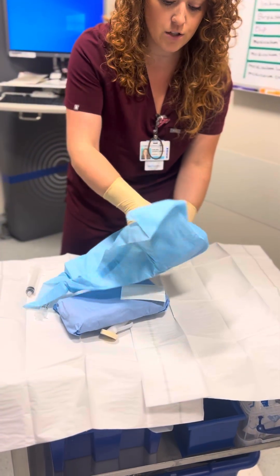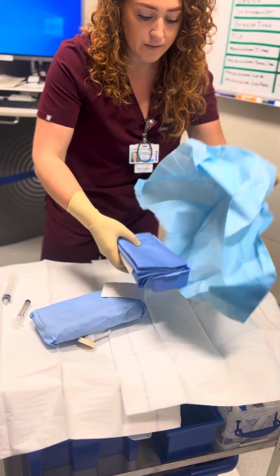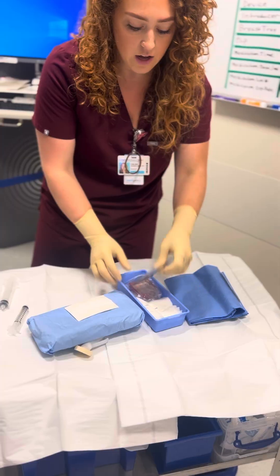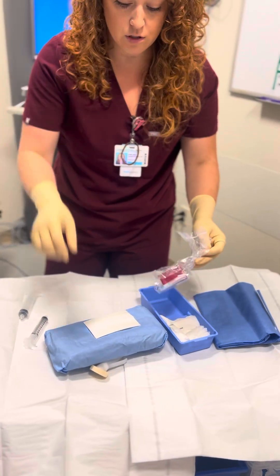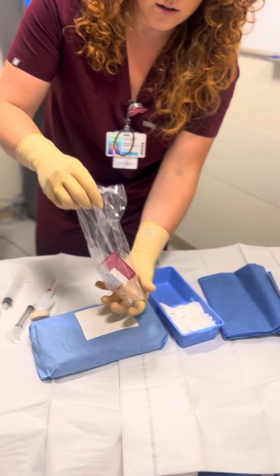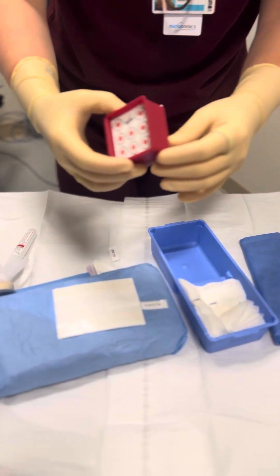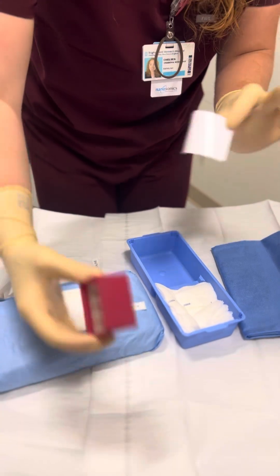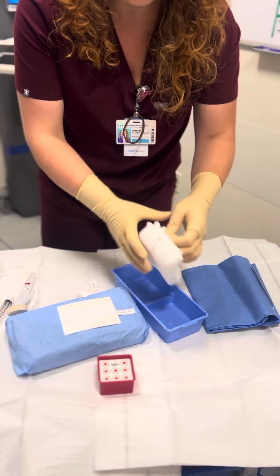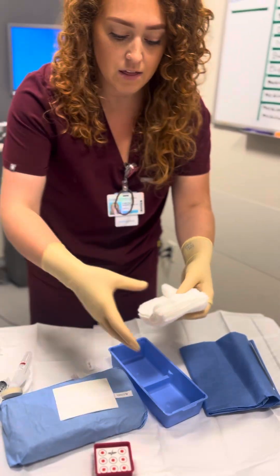I'm going to open the breast tray. We don't need this little blue cover — just what's inside. We don't use the chloroprep from inside the tray; we use the chloroprep that we already put down, so we're going to toss that one. There's a little sponge for sharps — I'm going to take the sticker off the back and place it right on the tray. That's for when the doctors are using needles; they'll stick them in there when they're done.